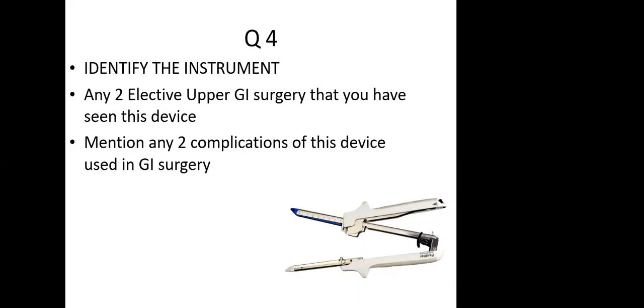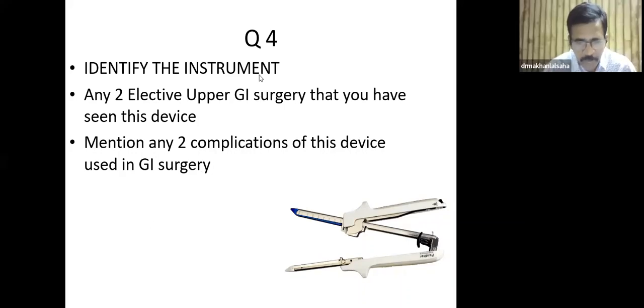Okay, right. We have blue, green, white cartridges. What is the idea of different types of cartridge? What decides the change in color?